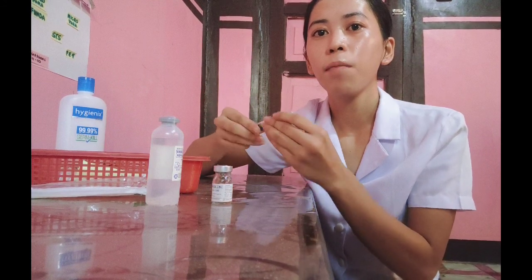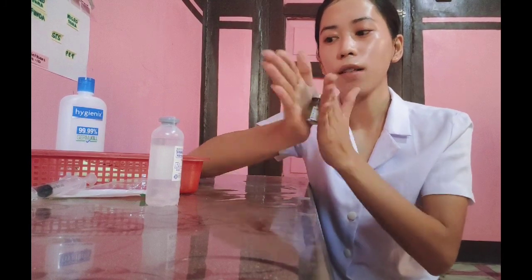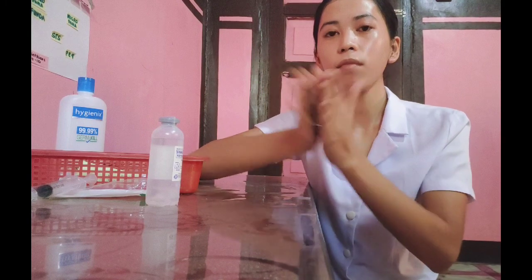And then mix the solution, rotating the vial between the palms of the hands, not by shaking. And then withdraw the medication.